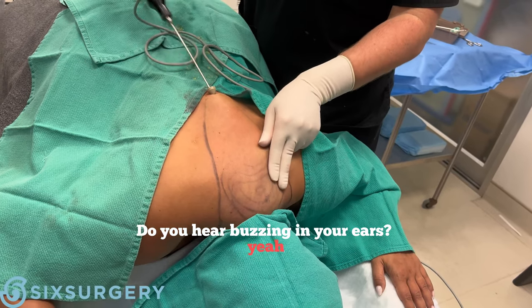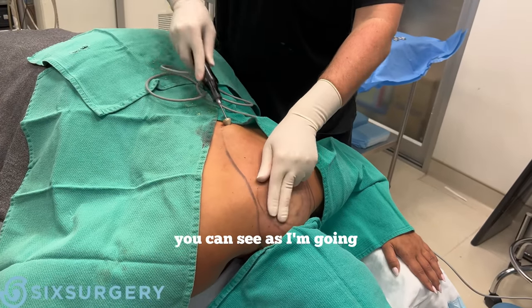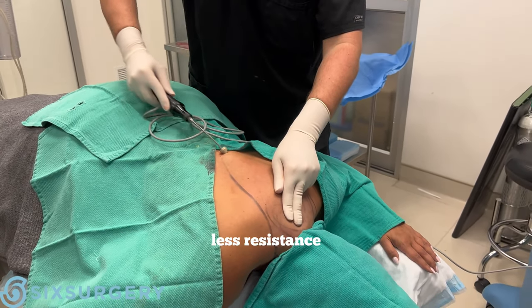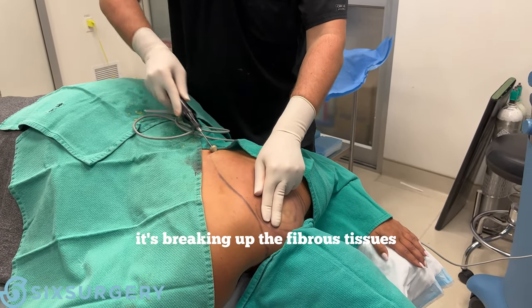Do you hear buzzing in your ears? Yeah. You can see as I'm going, it's already starting to get softer, less resistance — it's breaking up the fibrous tissue.